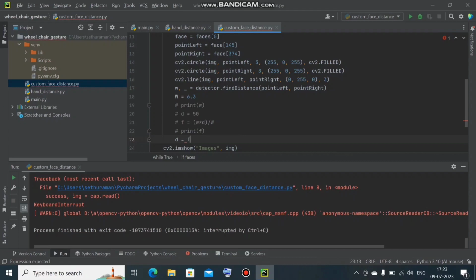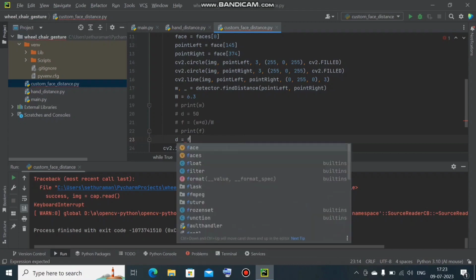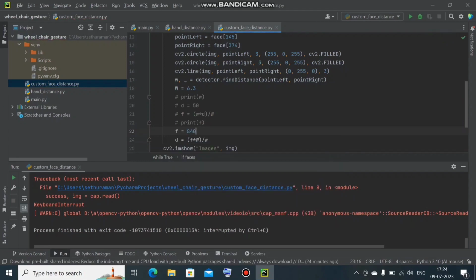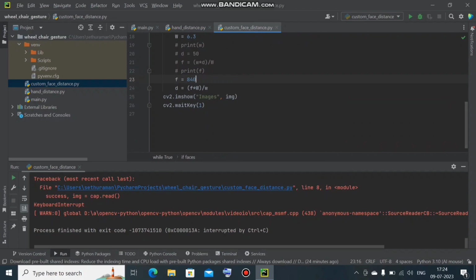So d is equal to f into capital W divided by small w. Focal length we need to define. Now we found f is equal to 840. Now let us print d.